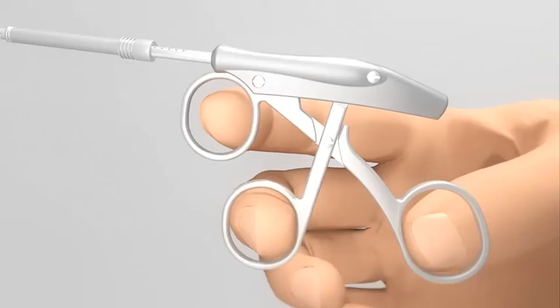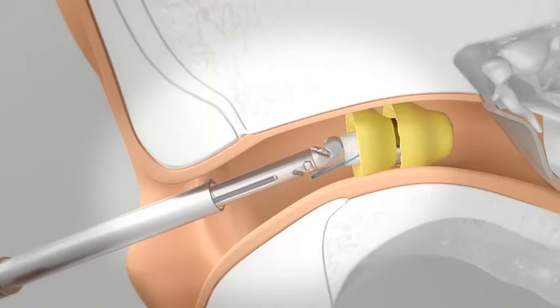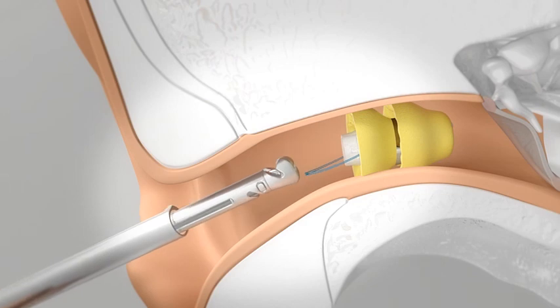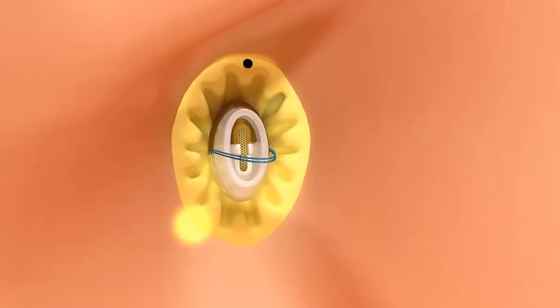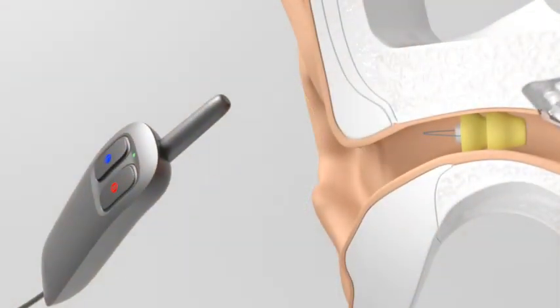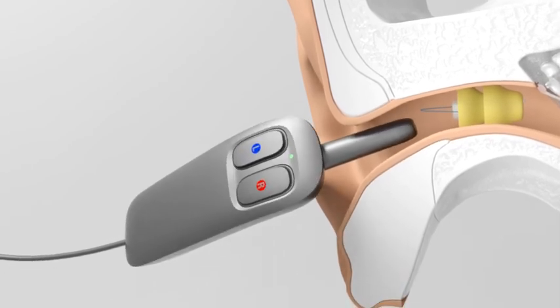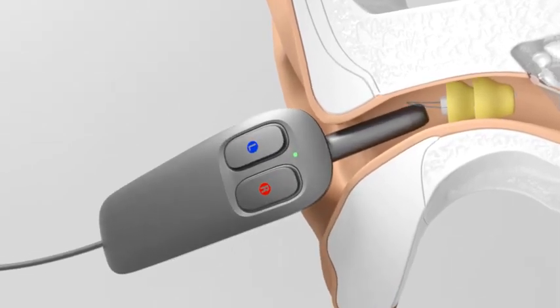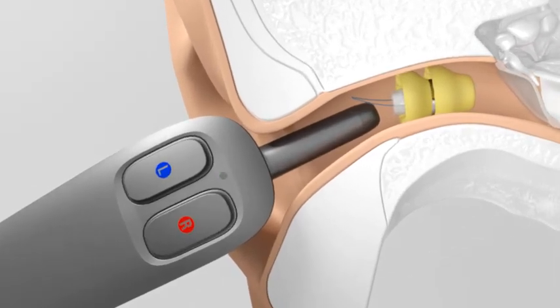Release the device by pulling back the moving tension ring completely. Remove the insertion tool and check that there are no gaps or folds in the seal. Repeat the programming and device placement process for the other ear. If any fine-tuning is required, hold the programming wand inside the ear and send the adjusted settings to the device. You have now successfully sized and placed the Lyric hearing device.